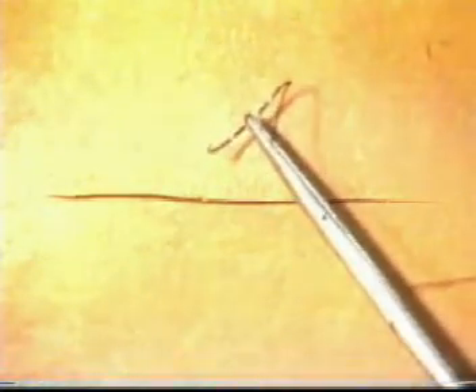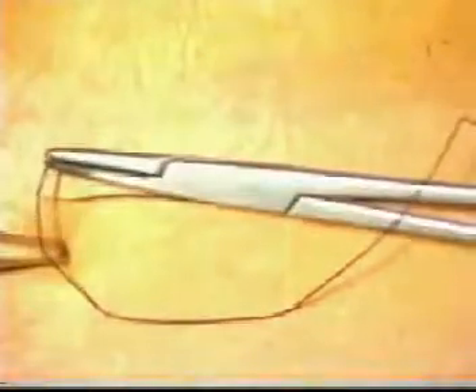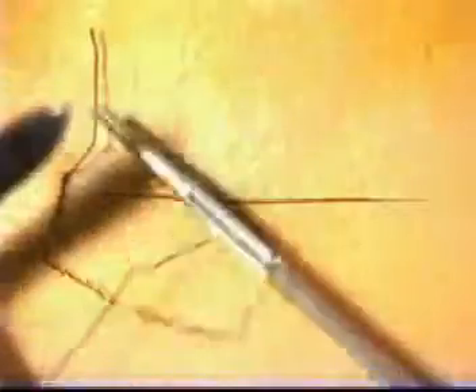Begin by making an incision on the simulated skin pad provided. We will now close this with interrupted sutures. Take a suture in your needle holder and insert the needle at right angles to the incision using counter pressure from the forceps. Pull the suture through gently without snagging it. Secure a standard reef knot, either using the one-handed technique or the instrument technique. Cut the suture to such a length as will allow it to be grasped for subsequent removal.